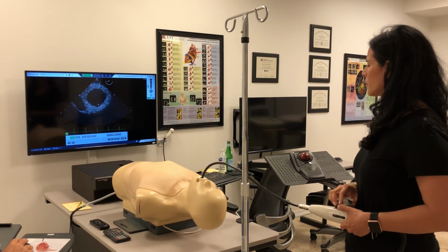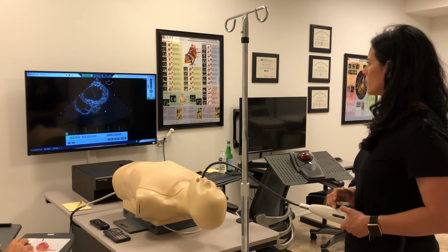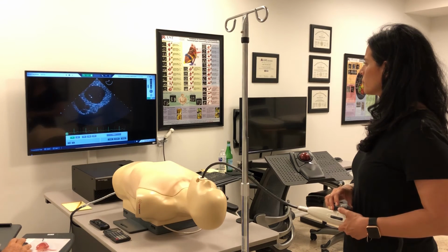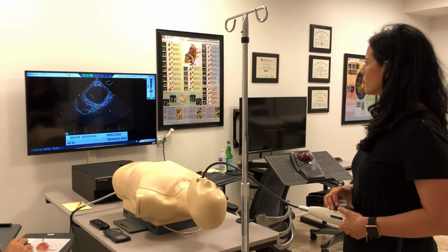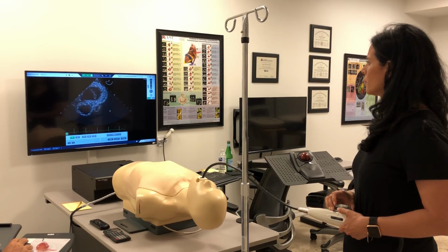Now, this is still an oblique cut, so let's introduce a little bit more anteflexion with the big wheel. Good. Now you're seeing a little bit here at the A2, you're seeing the actual cusps or scallops of the mitral valve. So let's just do a little bit more anteflexion. Not that much.